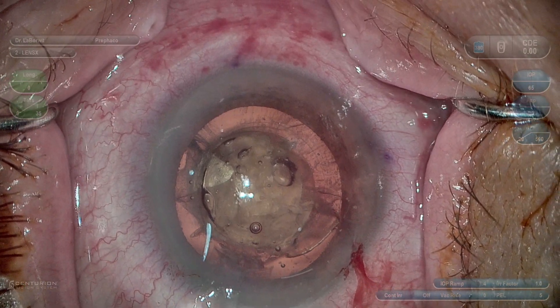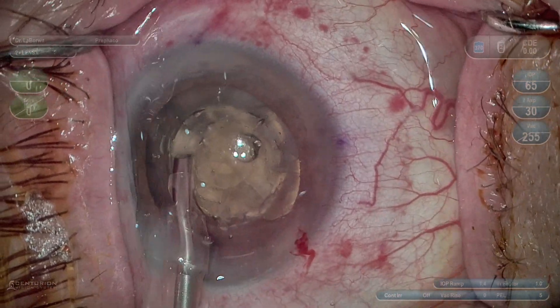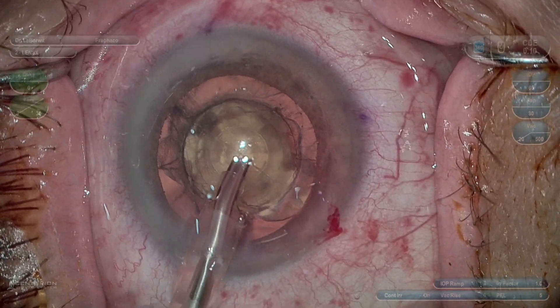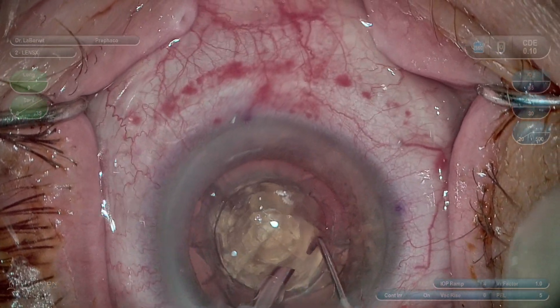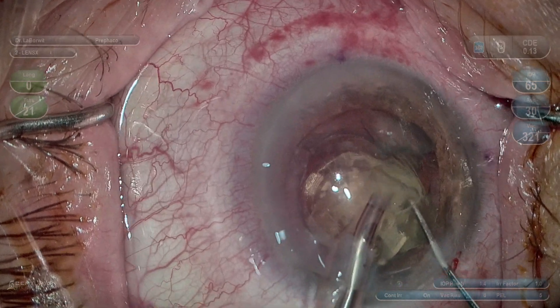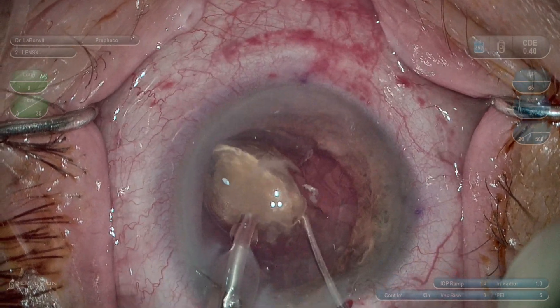The last case showed a softer nucleus; however, this is showing a very dense core nucleus and how you can leverage the femtosecond technology to remove the central plug for ease of removal, keeping your phaco tip within the capsulorhexis area. With the second instrument I'm able to crack the core plug off from the more peripheral dense area and then lift the plug up. Having the horizontal cut extend beyond the outer cylinder allows some gas to accumulate and creates potential space for a second instrument. The central plug is removed because the density of this cataract lined up with the cylinders.